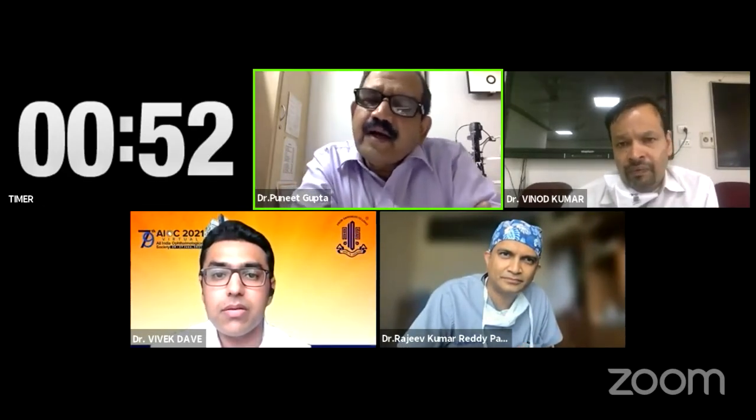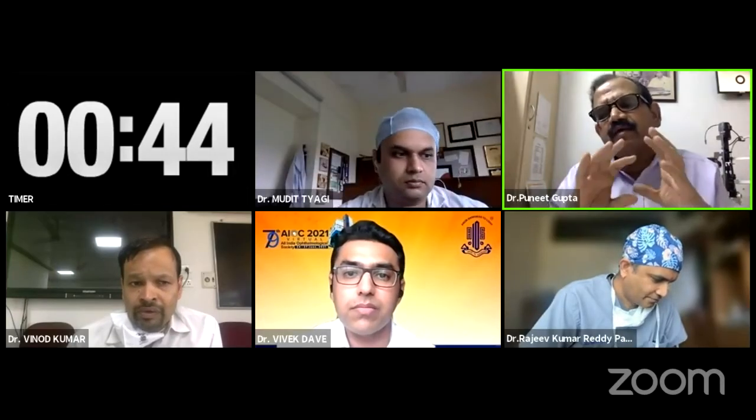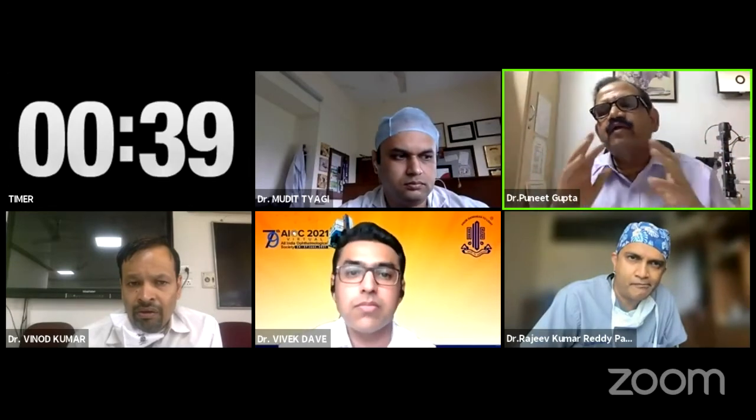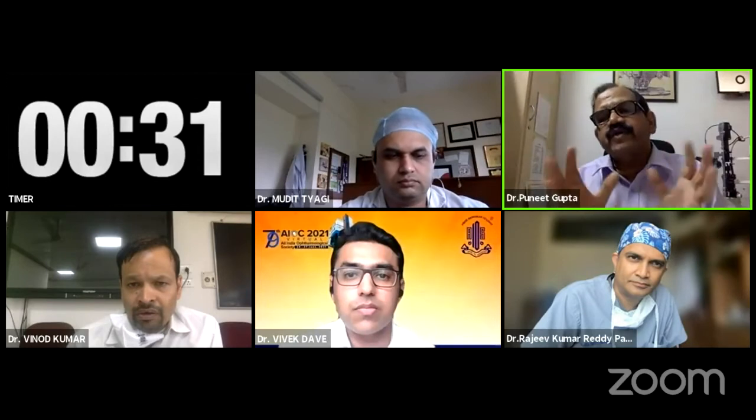Actually, the other issue that happens in patients of endophthalmitis is once you clear these organized exudates, still the vitreous cavity is filled with some hazy fluid. So it becomes difficult to visualize things through that hazy media, even if you have cleared the exudate part. The same thing happens in patients with vitreous hemorrhage also, organized vitreous hemorrhage and fresh vitreous hemorrhage. That becomes difficult, especially in patients with ocular trauma. I'm talking about vitreous hemorrhage. If you have removed the chunk of vitreous hemorrhage but there is still bleeding, it becomes very difficult to work on a blood-filled eye.